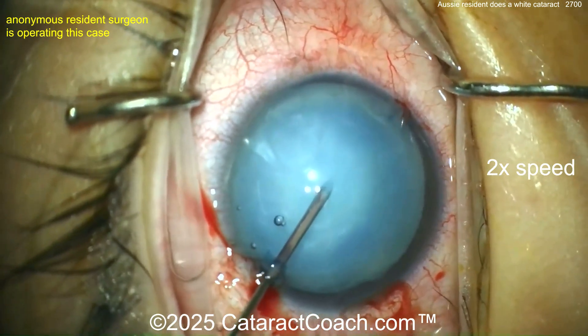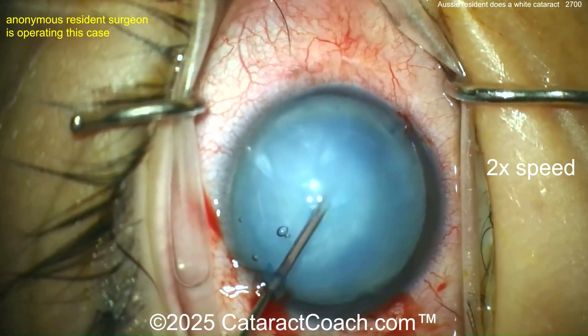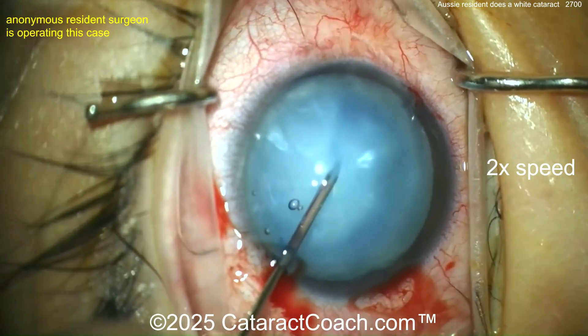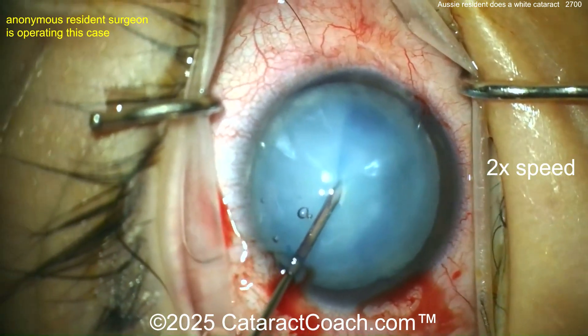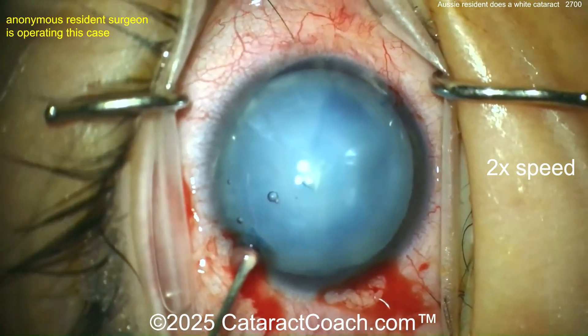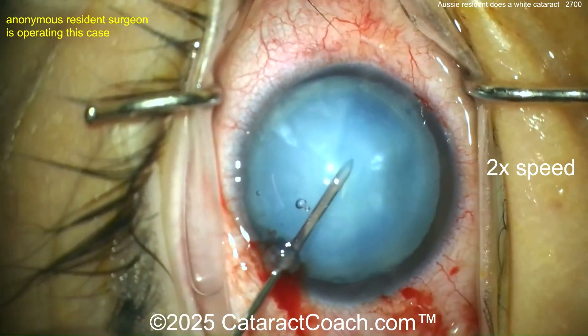There's the nucleus being pierced by the 27-gauge needle here, aspirating out some of that liquefied lens cortex. We had a video just earlier this week that makes you question: do you do this under viscoelastic or do it under moving BSS? But I'll leave that up to you.